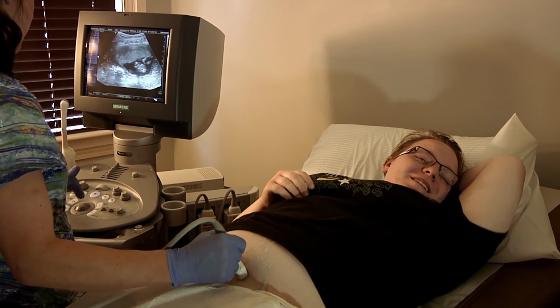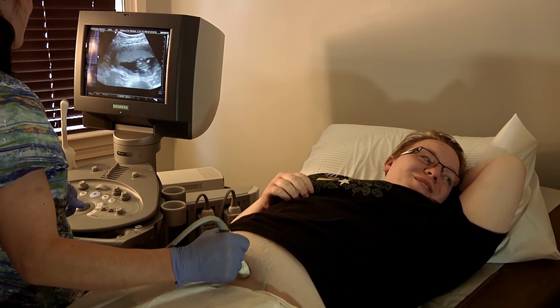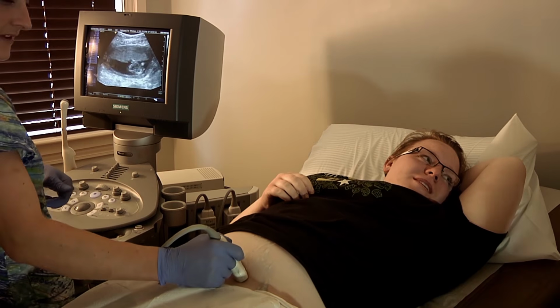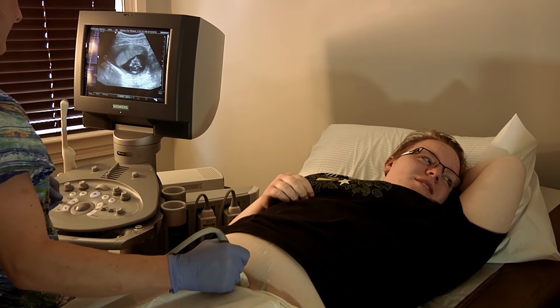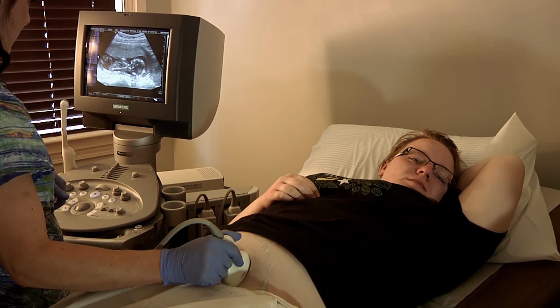Did you get that femur? Did you take it? How many weeks was it? 14-6. Okay, now let's get some cute pictures for Mom. You want to do that? No, you can do it. Okay. You want me to? You turn and get the long axis of baby. There's baby.